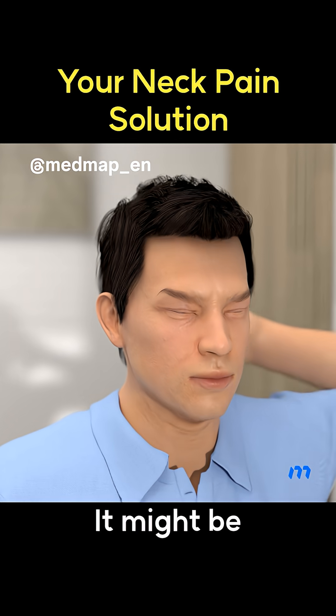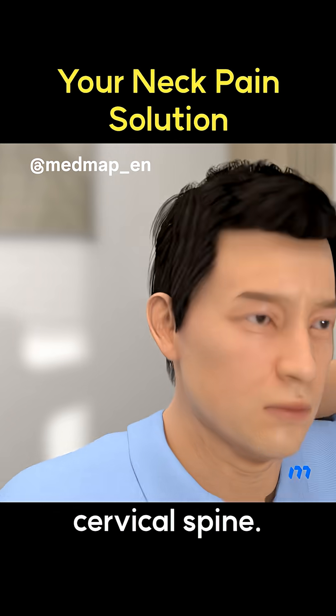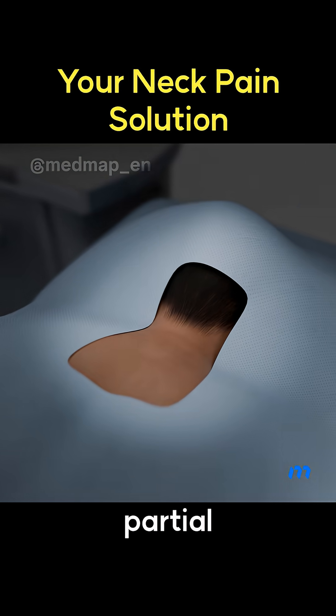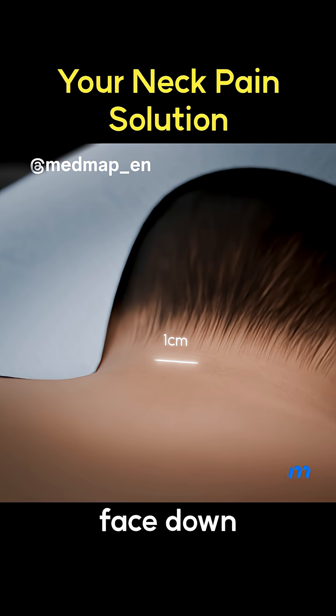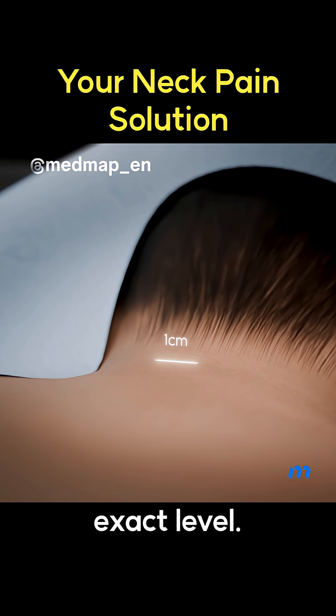Is your neck pain getting worse? It might be a disc pushing on the nerves in your cervical spine. In the partial pediculotomy-partial vertebrotomy approach, the patient lies face down on a Wilson frame, and X-ray guidance helps locate the exact level.